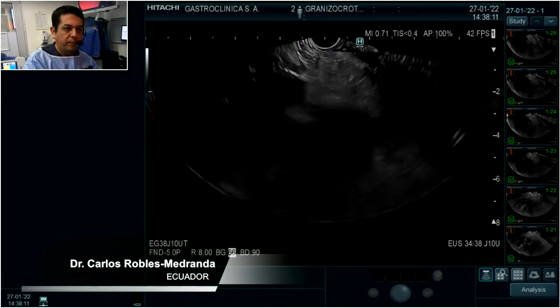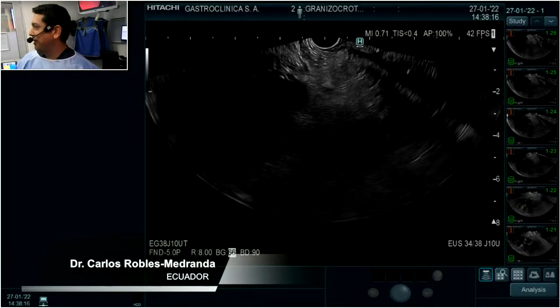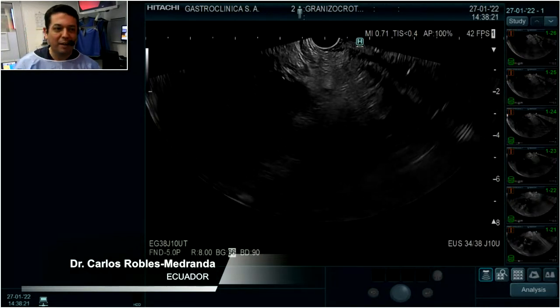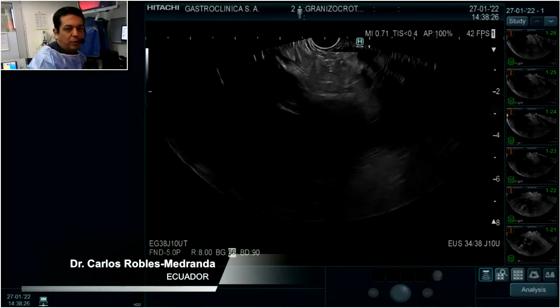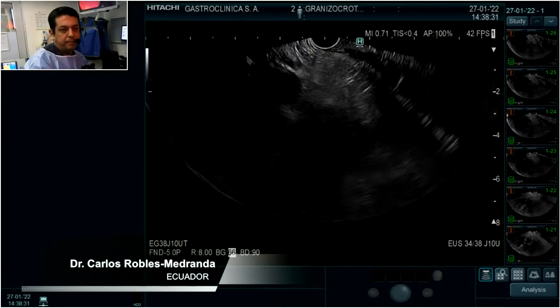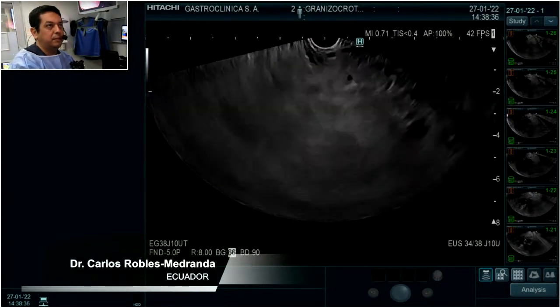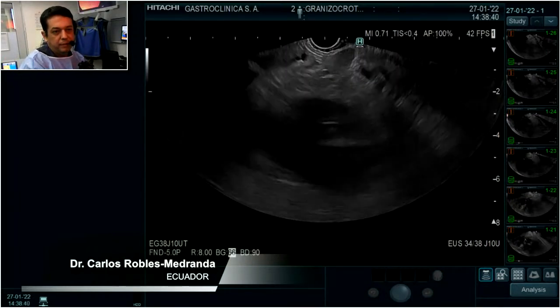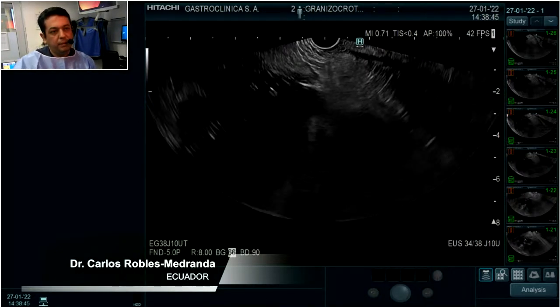Yes. So Daniela is saying to me that I need to explain that I am in the duodenal lumen, so I am explaining now that I am in the duodenal lumen, okay? So I will try to see here. Or maybe here.